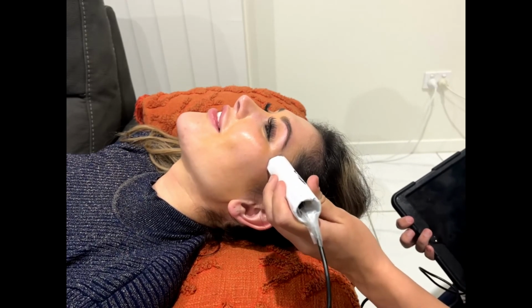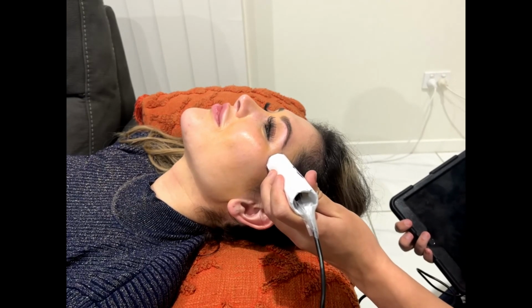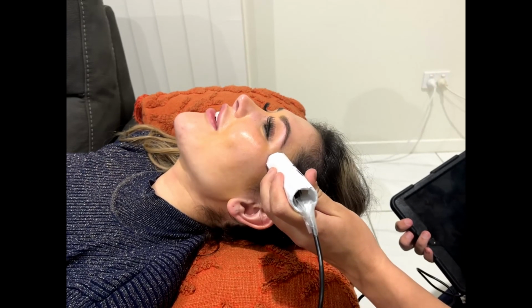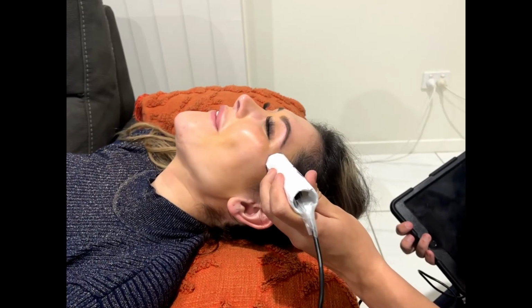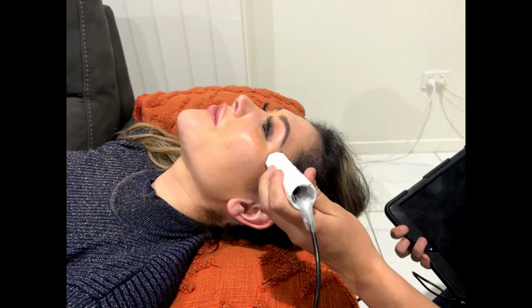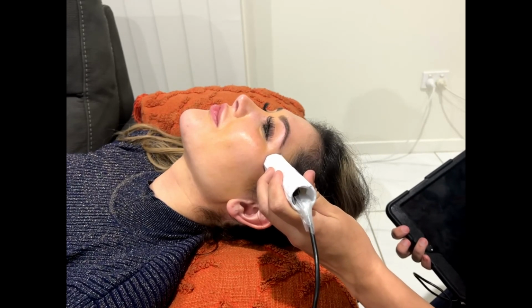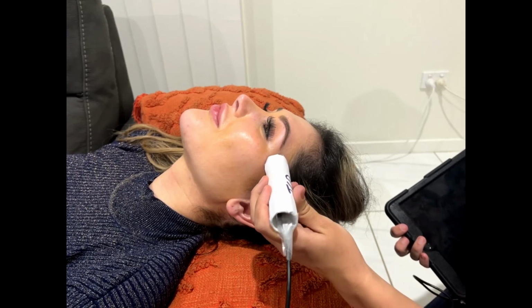Blood flow velocity is calculated according to the Doppler effect, and cerebral blood flow is reflected by indicators such as blood flow velocity and pulse index. Doppler sample volume depth should be placed where it is likely to find the bifurcation of the internal carotid artery to the middle cerebral artery and the anterior cerebral artery, as this is an area rich with vascular flow. Turning on the color flow will then allow for the identification of cerebral anatomy.